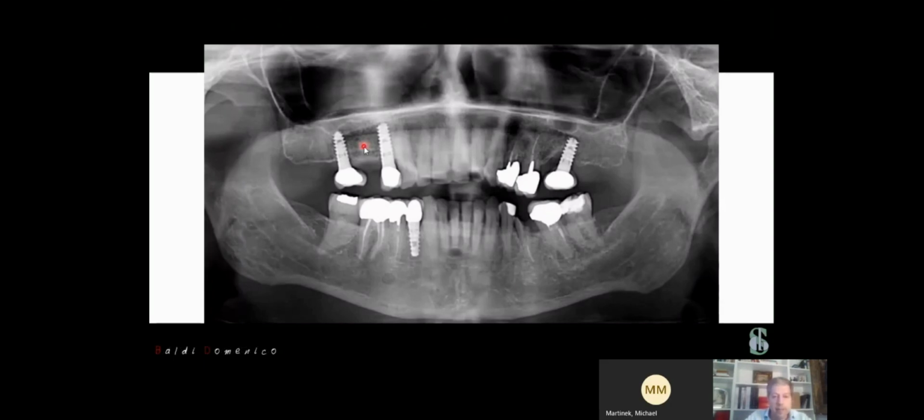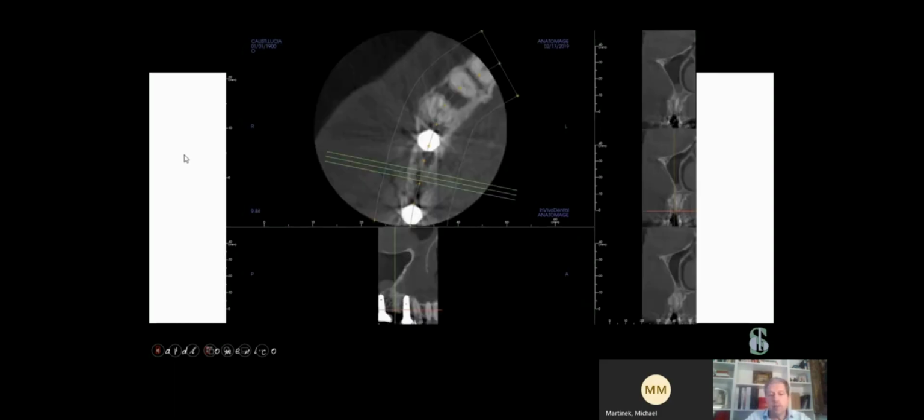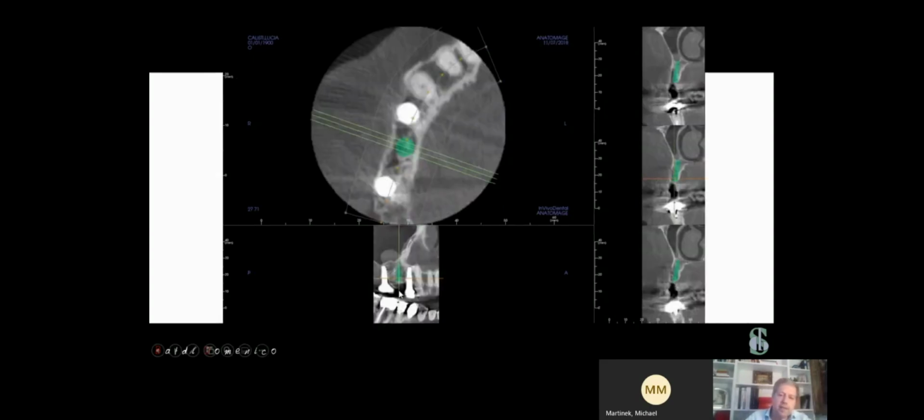We decide to place an implant here, and analyzing the OPT, it looks very simple to place an implant here. But if we analyze the CT, it's possible to see two points. The first thing is that here we have a damage of the bone that it was impossible to see only with OPT. So it's necessary, first of all, to clean this damage and to make a regeneration. And when we make the regeneration, we obtain this kind of bone that is good, but is not fantastic to place an implant. So our project is to place an implant here. It means that we want to place a fixture there in order to have a good result, but we need a good result from the long-term point of view.